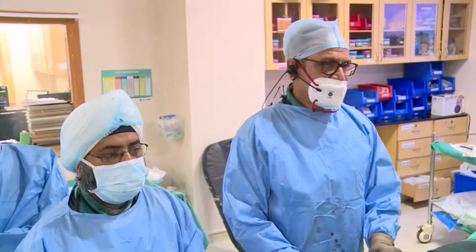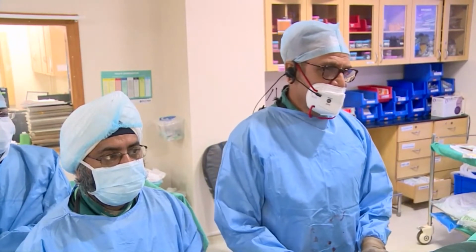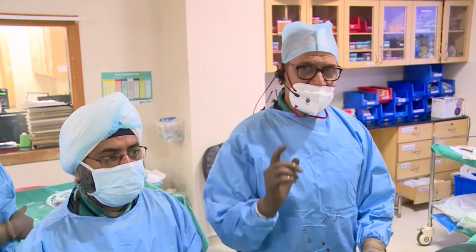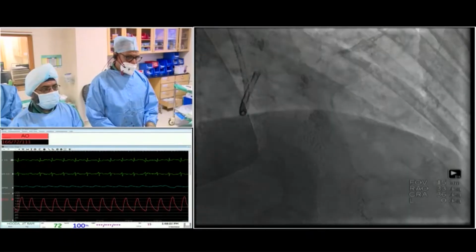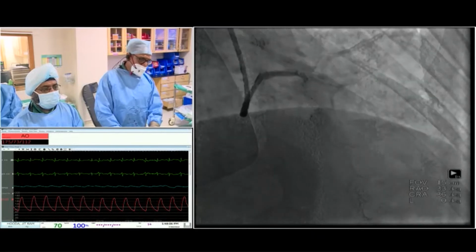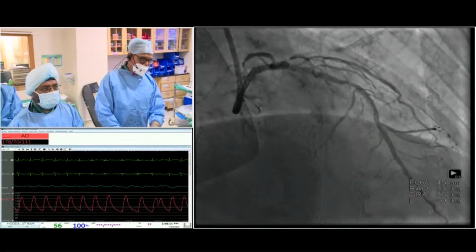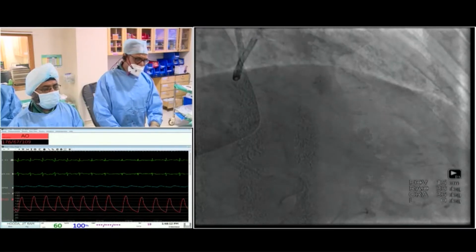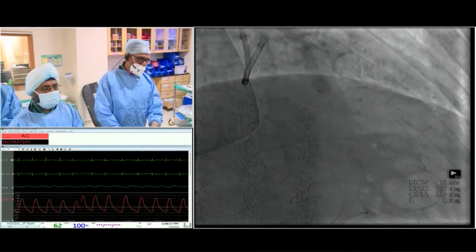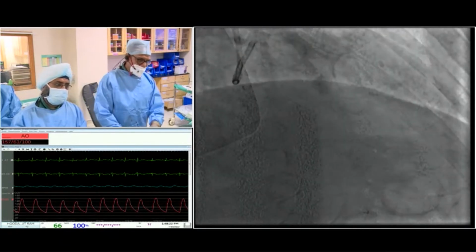Can you run this, the angiogram of the 87-year-old Mr. Huda. Show the angiogram, please. This is a case of unstable angina. Yeah, we can see it. That's the angio. So he is an octogenarian who had an MI in 2007, an inferior wall MI leading to RCA occlusion, which is supplying an akinetic segment. EF is 40%, and we have a bifurcation lesion here. It looks like a trifurcation on the spider view.